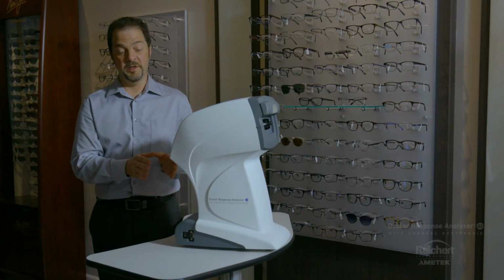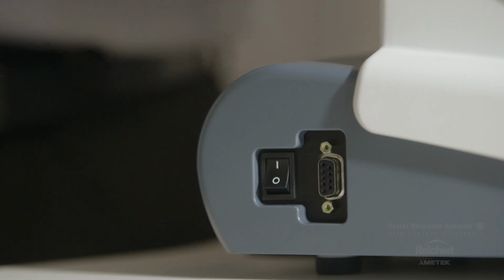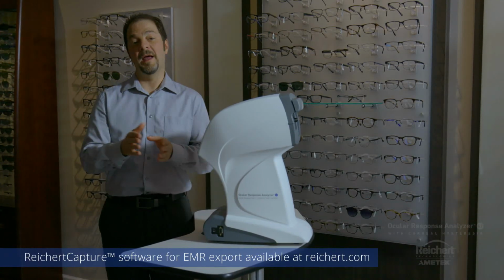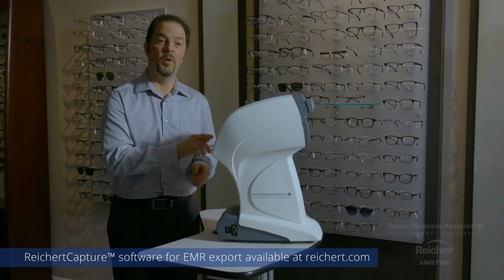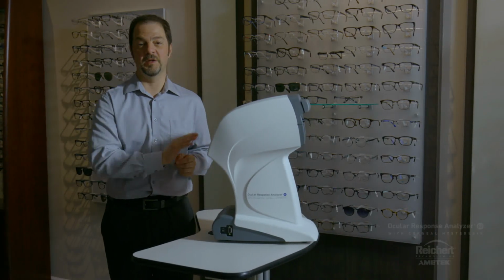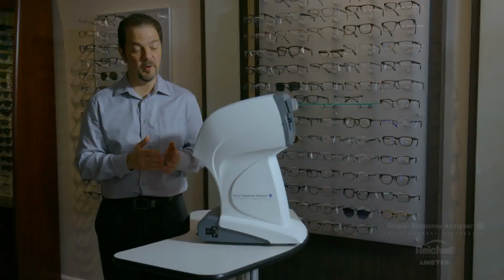Now, if your instrument is connected to an EMR system through the RS-232 port on the side of the instrument, this print button here will print and export the data at the same time. If you don't want to print the paper, you can go into the setup menu, turn the printer off, and then this button here will simply function as an export button. I think it's worth talking about exporting the data for a moment.